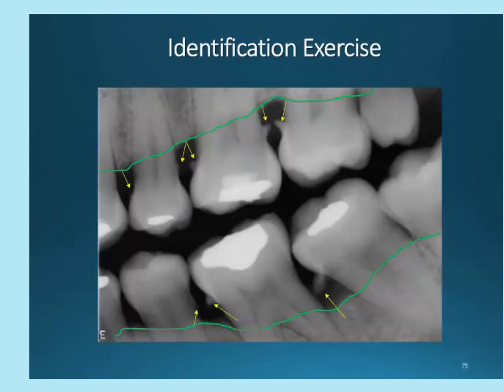This image has a lot of calculus and bone loss. We have not discussed calculus classifications, and we don't usually perform calculus classifications through radiographs. Not that it's not possible, it's just not accurate. Bone level is drawn, and I would classify this patient as a class 3.